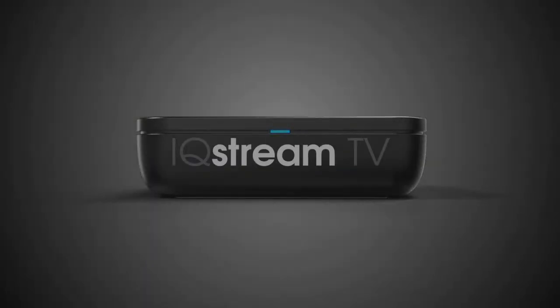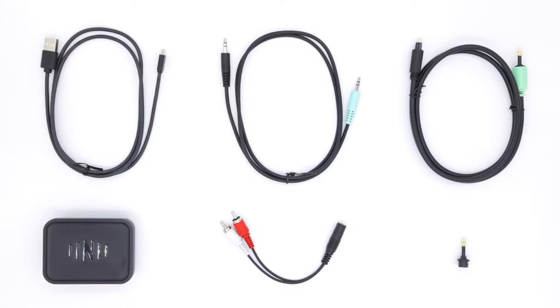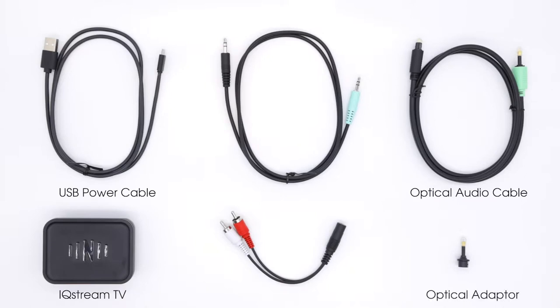Thanks for buying the Nuheara IQ Stream TV Personal Audio Streamer. When first unboxing, check you have all the items in the box. You will have six items: the IQ Stream TV, a USB power cable, an optical audio cable with adapter, the 3.5mm auxiliary cable, and the RCA adapter cable. If you are missing any of these items, please contact us at team@nuheara.com.